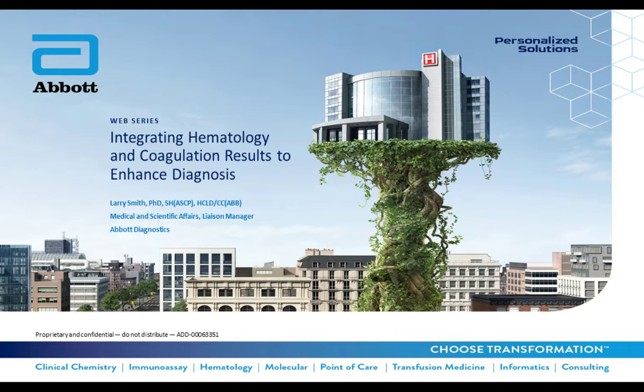within the normal limit. In the case of the CLL, the same would apply. We can use both the hematology and coagulation laboratories to monitor improvements in some of these bleeding abnormalities as well as the anemia that these patients present with.